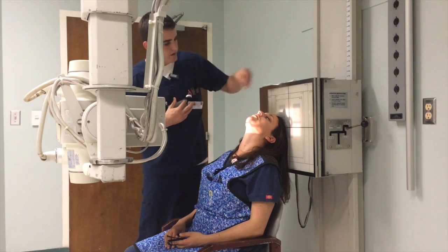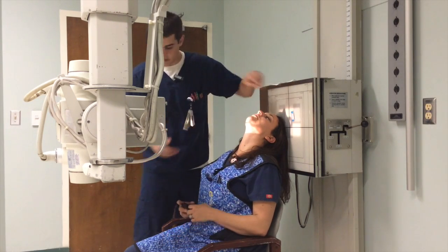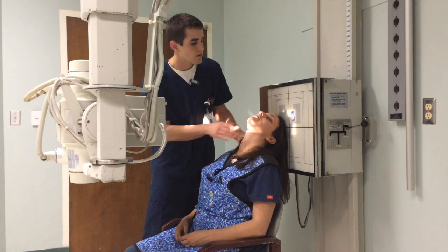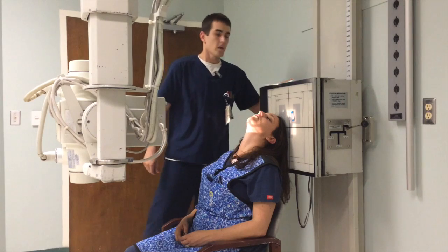Put a left marker on there. Right there.